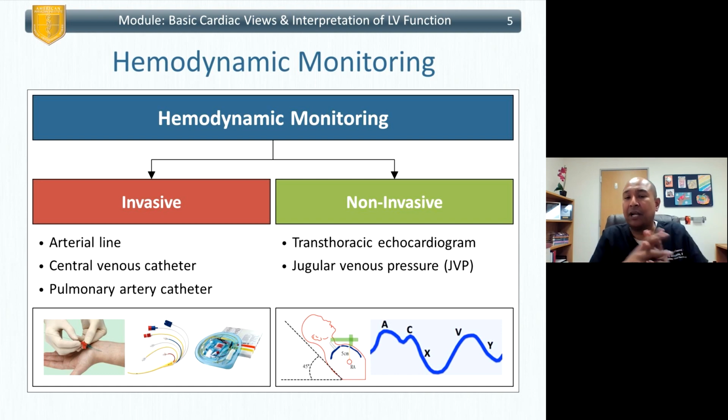Now, how do I start this lecture and why are we using the ultrasound? Well, if I were to ask you the question, is shock defined by having low blood pressure? Well, the answer is kind of not really. Don't get me wrong, all shocks pretty much have a low MAP, but shock is all about impaired tissue perfusion. Problems with oxygen delivery, problems with oxygen consumption.